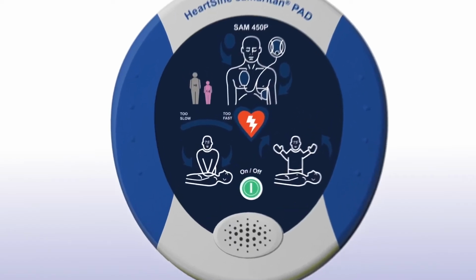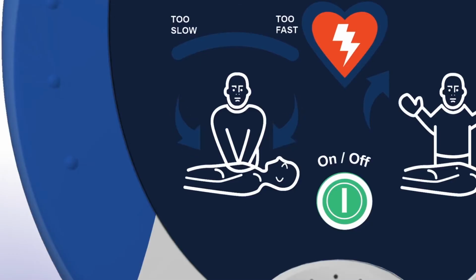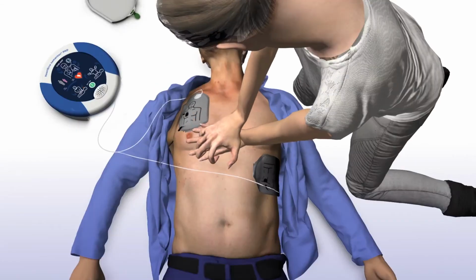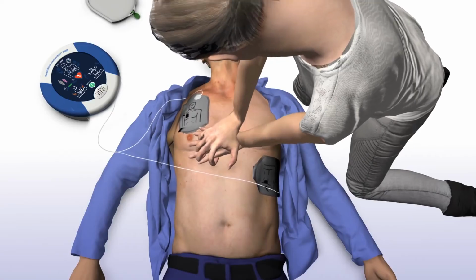The SAM 450p with CPR Rate Advisor will prompt you to begin CPR and will continue to do so until you begin chest compressions. Begin CPR. It is safe to touch the patient. The SAM 450p will tell you how and where to place your hands, as well as provide you with real-time audio-visual feedback on the rate of your chest compressions. Place overlapping hands in middle of chest. Press directly down on the chest in time with metronome.